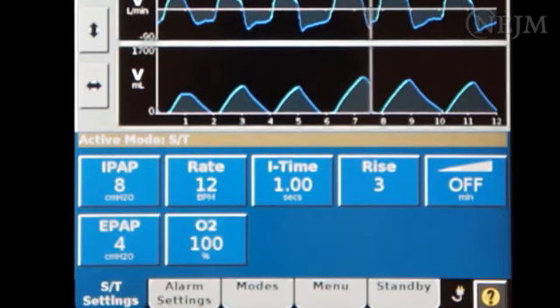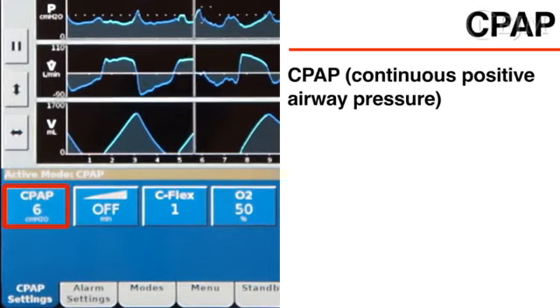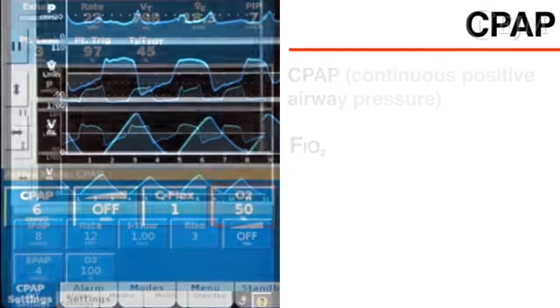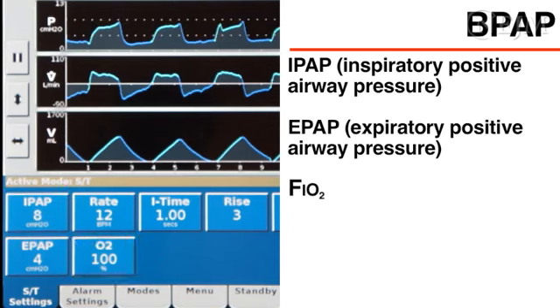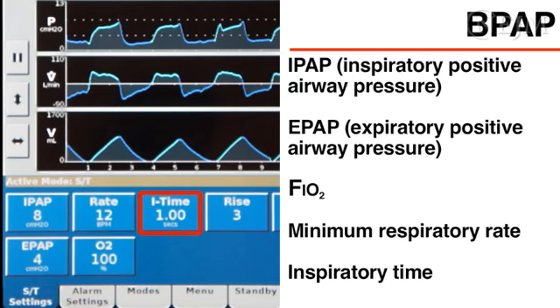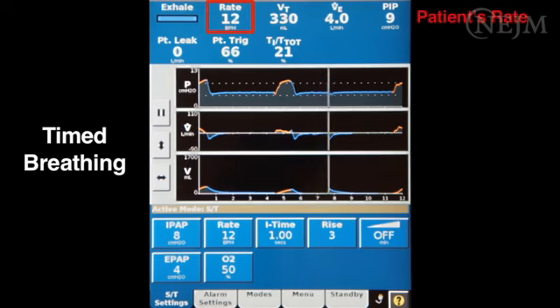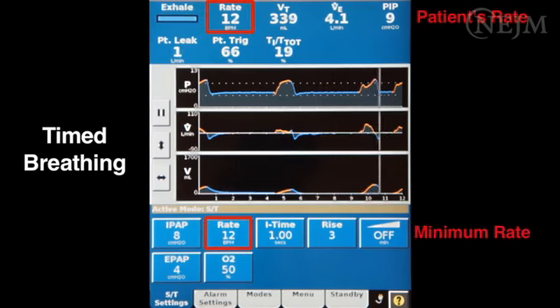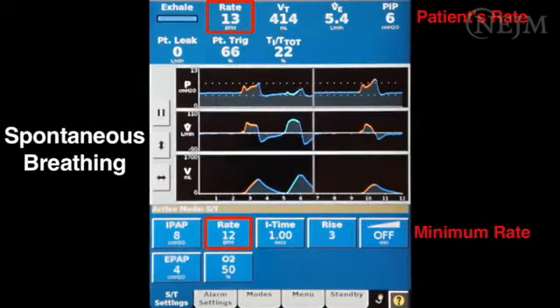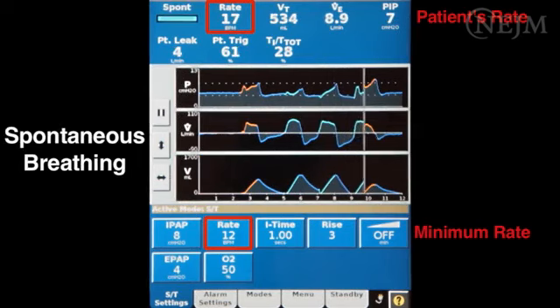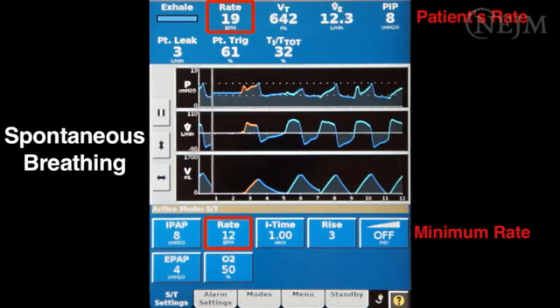The available settings depend on the mode. In CPAP mode, the basic settings include CPAP itself as well as FiO2. In BPAP mode, the basic settings include IPAP, EPAP, and FiO2. BPAP is most often delivered in the combination spontaneous and timed, or ST, mode, in which the settings also include the minimum respiratory rate and the inspiratory time. If the patient's respiratory rate is slower than the minimum rate, the ventilator triggers additional breaths at regular intervals, delivering IPAP for the duration of the inspiratory time. If the patient's respiratory rate is faster than the minimum rate, the patient triggers all breaths, and the ventilator delivers IPAP whenever spontaneous inspiration is detected.